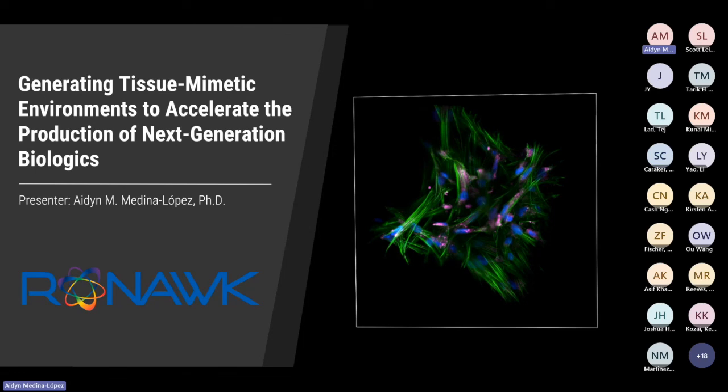That is an excellent question, especially because I think it was the first question, and how are we making sure that what we're having is tissue-like. So interesting enough, the longer the cells are cultured in the bioblocks, the more difficult they are to get out of the bioblock. The reason being is the older the culture gets, the more complex that tissue-like structure is, and you have to treat it like tissue at that point.